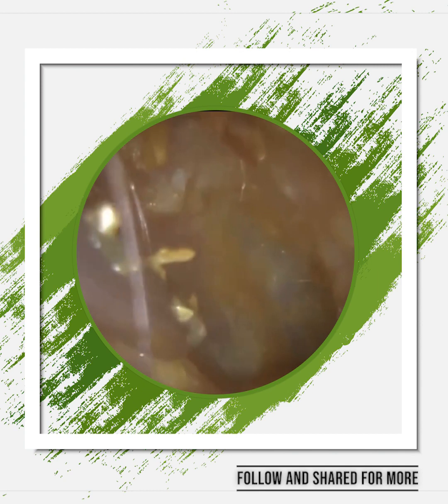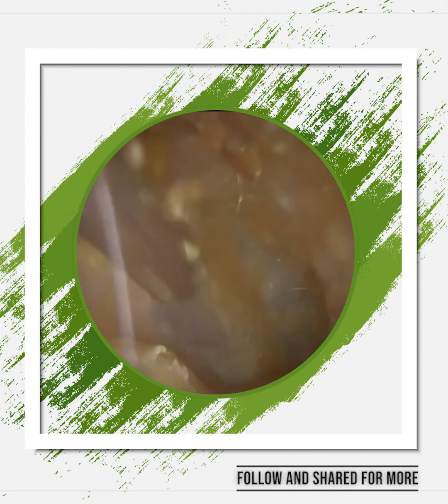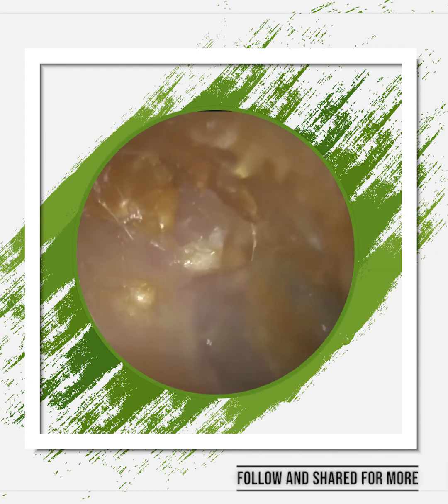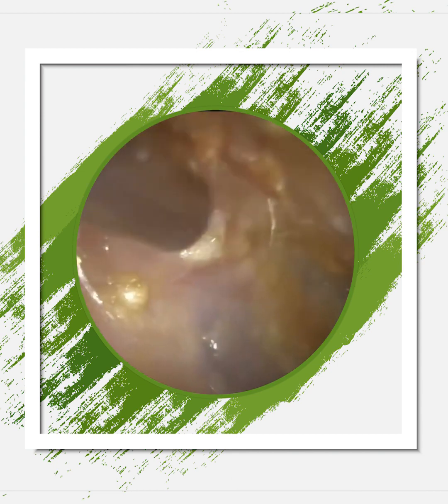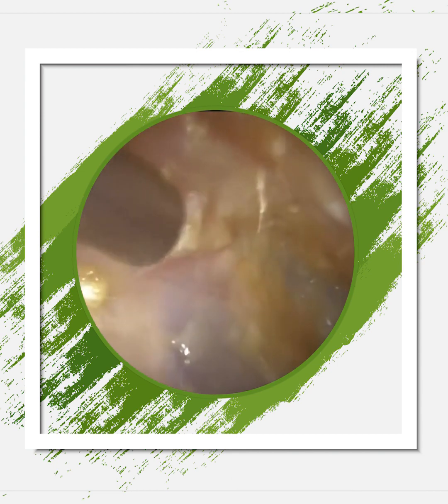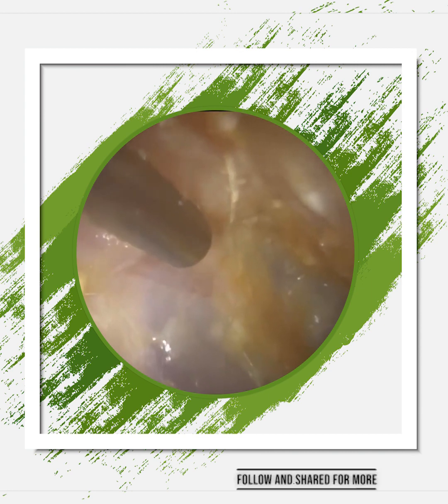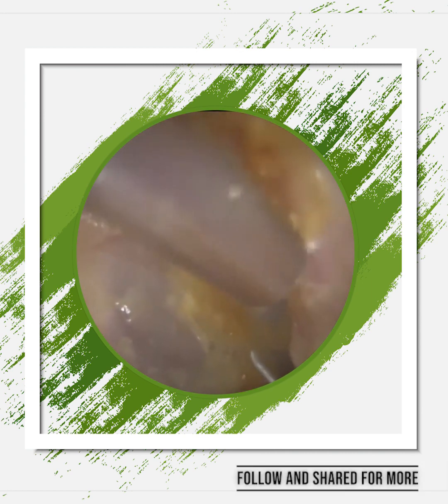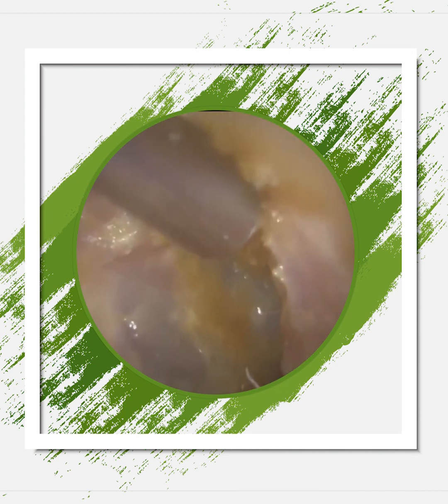So I'm actually at this stage already quite happy. Now the ear will have to dry up. When you suction, the dampness is still there, unfortunately. But the main thing here is just clearing the ear. It's clear now. You can see there's a bit at the top. I just thought, let me just hover over. And again, I'm just approaching the eardrum there, so the patient could hear back to normal again.